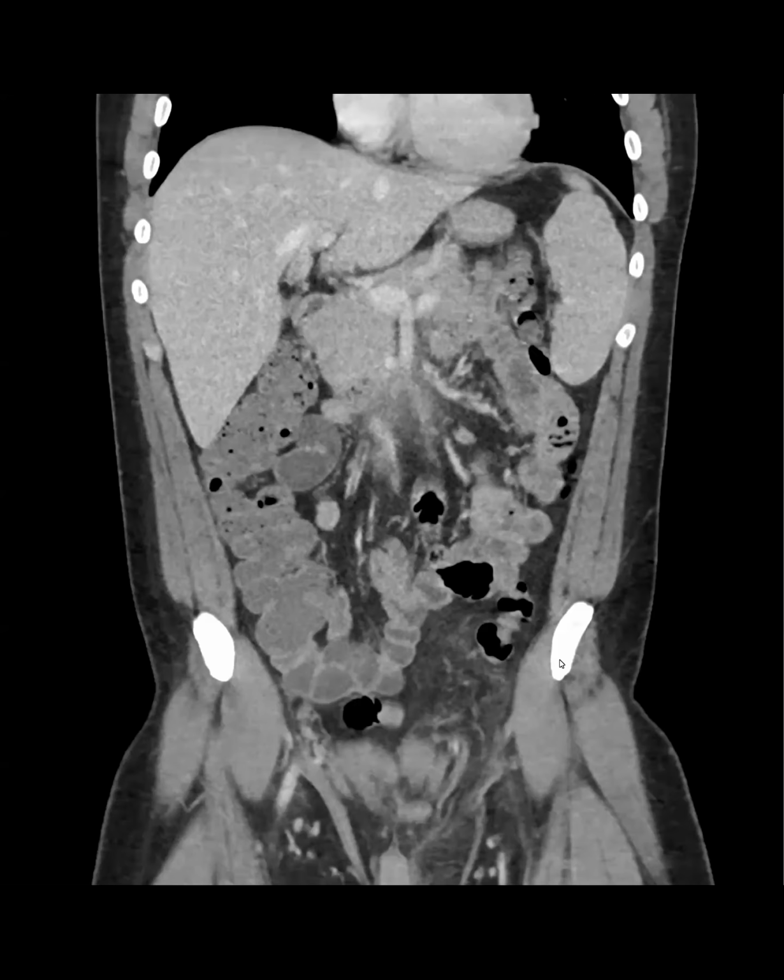So before I would just go through these cases, but now I'm a little bit more mindful of the rectal wall, to make sure that it's not within the rectal wall. Recently we got this new gel, and it's supposed to be an improvement. Before, when you injected the gel, apparently all of it went right through. With this new gel, it's supposed to be more viscous so that it's more controlled. And we've seen a couple of these complications that we never saw before. I don't know what's going on, but yeah.